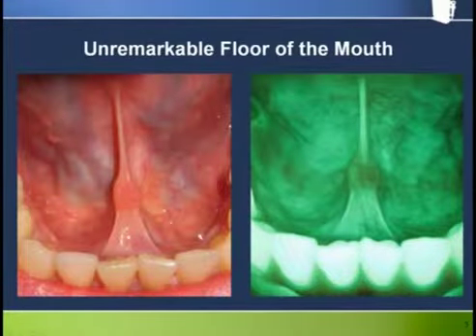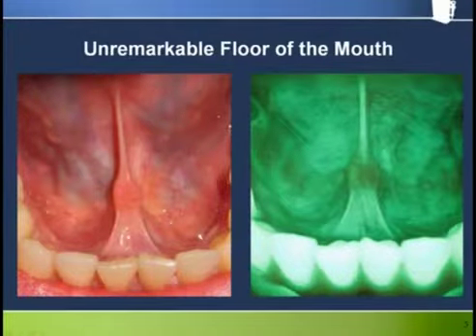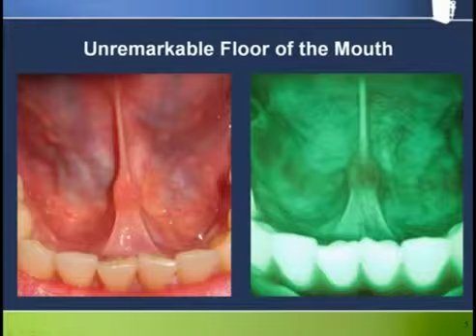This is a fairly unremarkable picture of the floor of the mouth, presenting generally speaking as a bright green with some loss of fluorescence around the sublingual gland. In a few minutes we'll see that this can be much more pronounced in some cases.